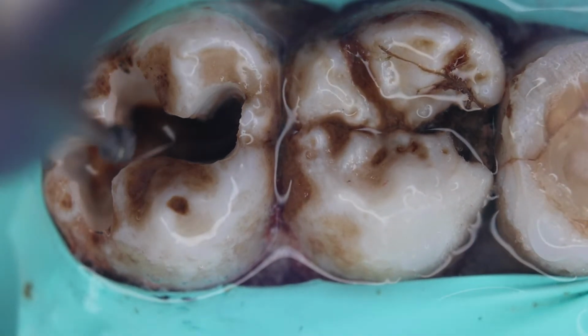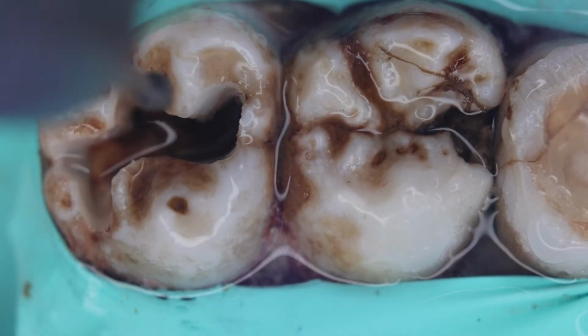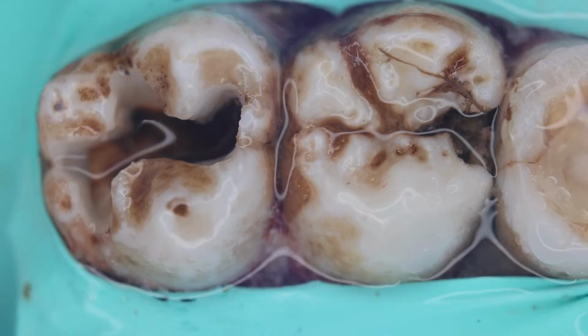So now you can appreciate that there is healthy tooth structure, the healthy dentine that we can see, and the caries that is still remaining.